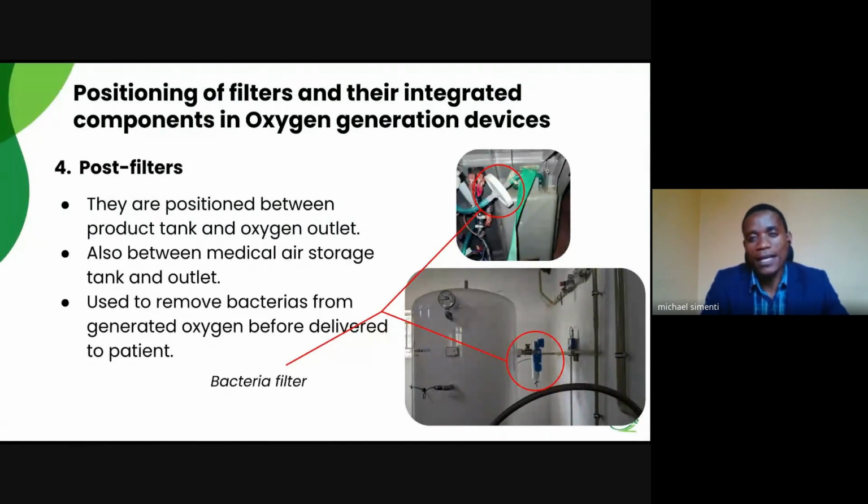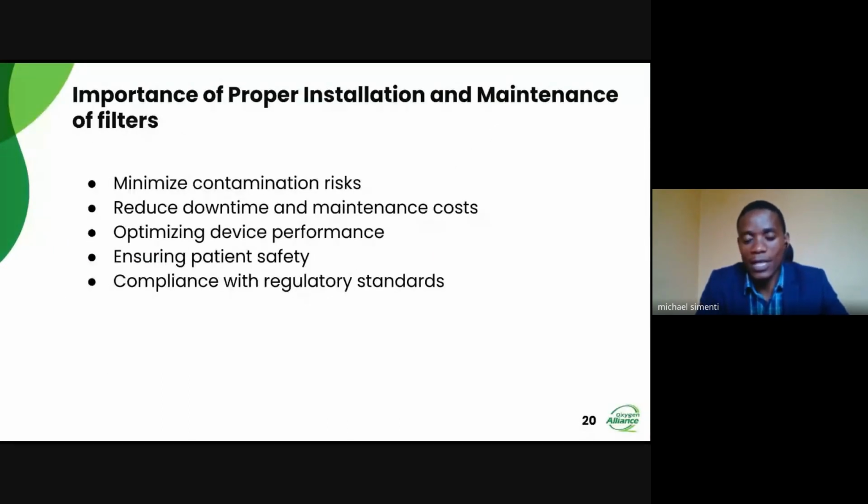Having looked at the position and some components that are integrated with these filters, let's focus on the importance of proper installation and maintenance of these filters. As engineers, we need to take into consideration the great importance that comes from properly installing and maintaining these filters, due to that good practice. The first one is that we are able to minimize any contamination risks.